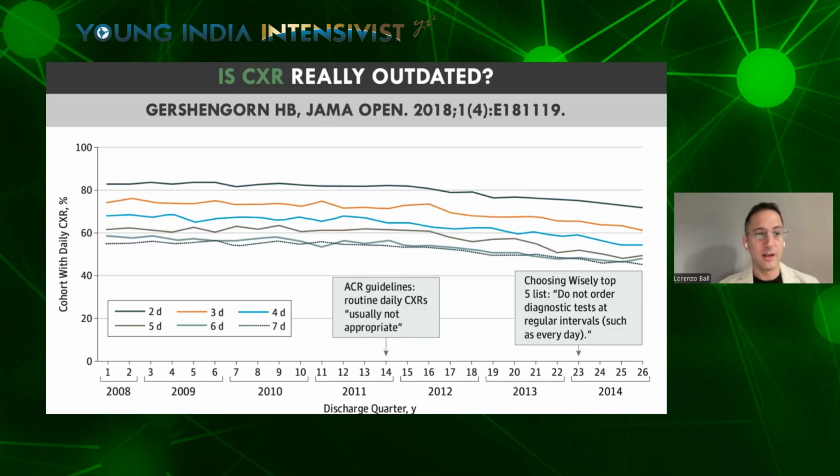The number of daily chest X-rays performed in the ICU was still high. At the beginning of 2014, there was another statement not to order chest X-ray exams at regular intervals, such as every day, but still people do a lot of chest X-rays. I'm not saying that we should perform a chest X-ray daily as we did 20 years ago, but there are still many centers that do a lot of chest X-rays. And can we quantify something also from the very simple chest X-ray?